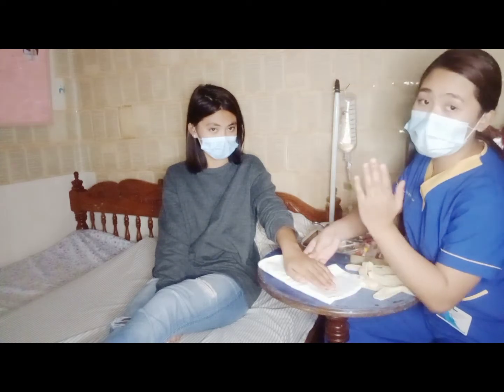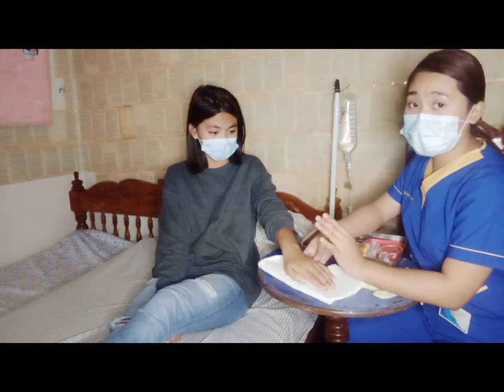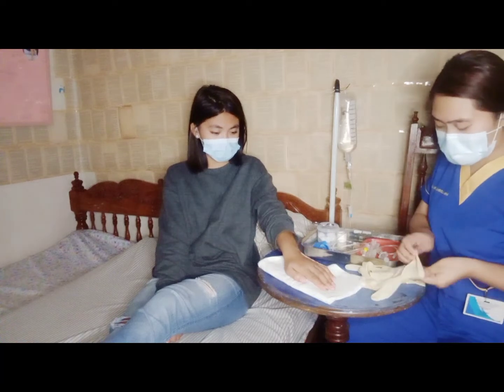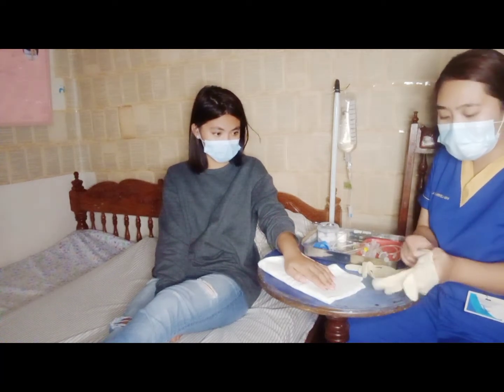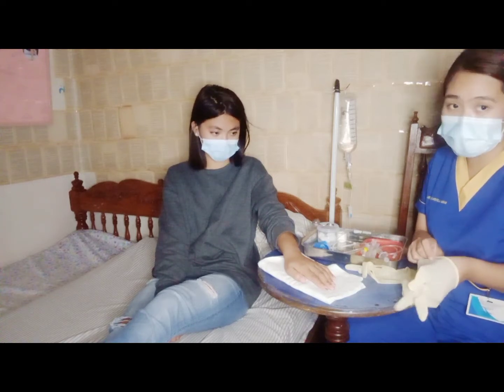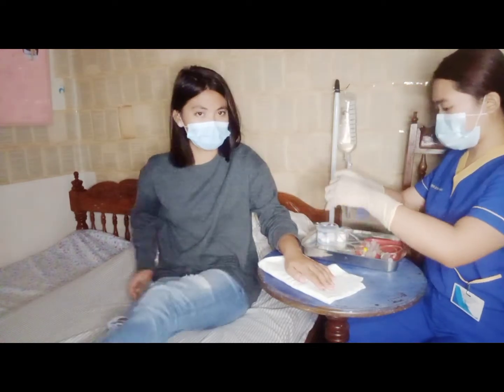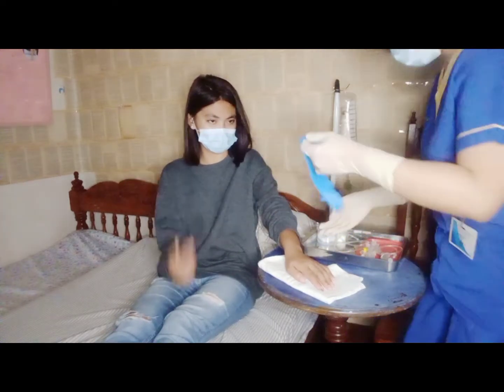Okay, so if the patient is hairy, we will shave the entry site because hair can harbor microorganisms. Okay, so let's put on gloves. This is to prevent contact to blood or body fluid and to prevent contamination. Then, after putting our gloves, we will put a tourniquet 3 to 4 inches above the entry site.